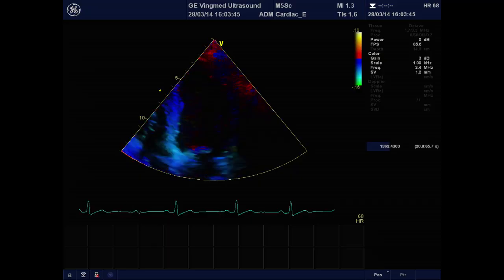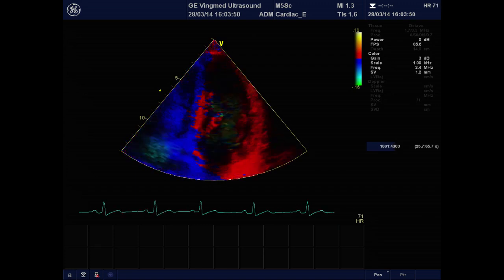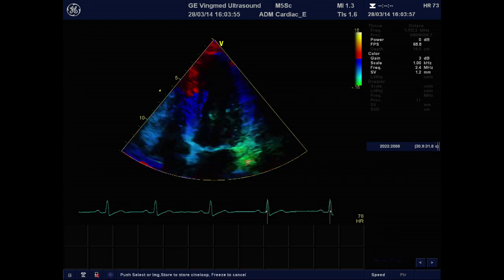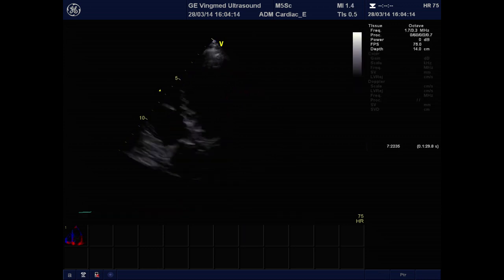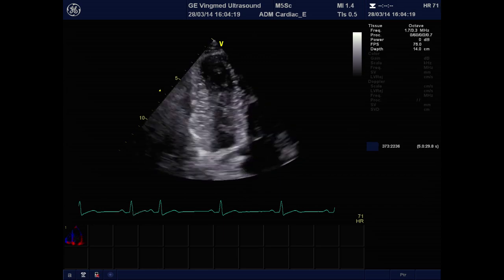And if you have this image, you ask the patient to hold breath, and then you can acquire your images. Can you please stop breathing? Breathe out and stop. I'm usually acquiring 3 cardiac beats, not only 1. Tissue Doppler can sometimes be a bit noisy, so it's good to have 2 or 3 beats to compare. I increase therefore the acquisition to 3 beats and store this image. That's basically it. And now you move to the 3- and 2-chamber view and repeat the same procedure.